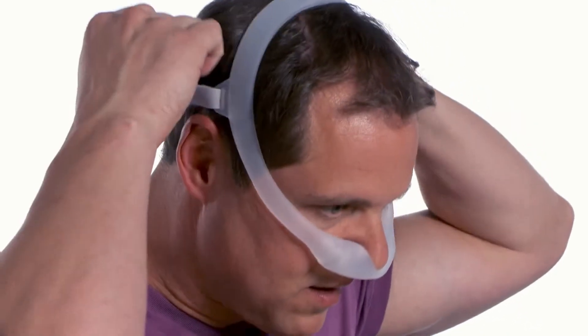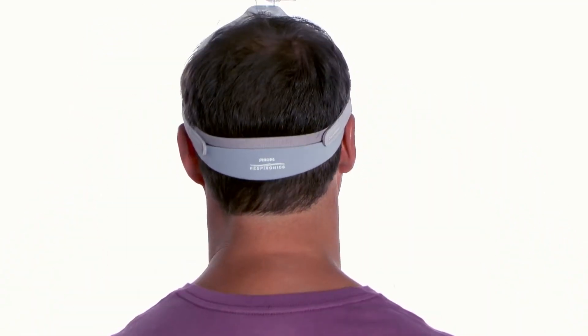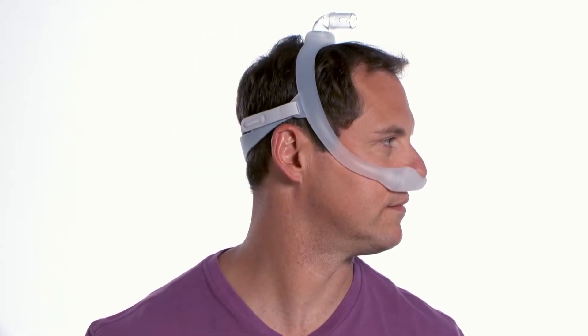To put the mask on, hold the cushion in place beneath your nostrils. Pull the headgear down until it sits across the back of your head. Position the frame on top of your head.